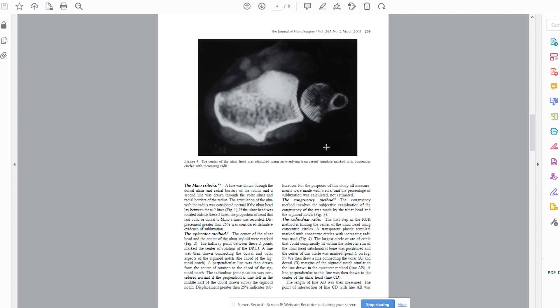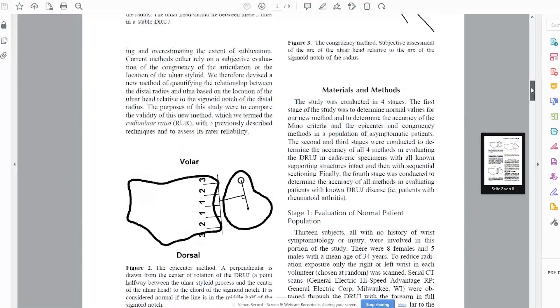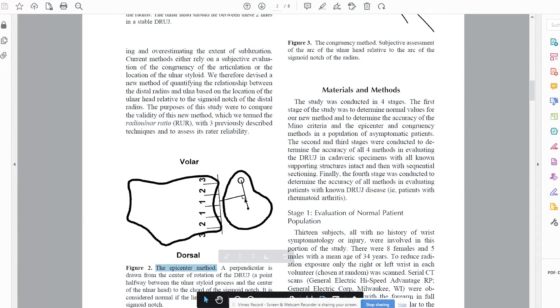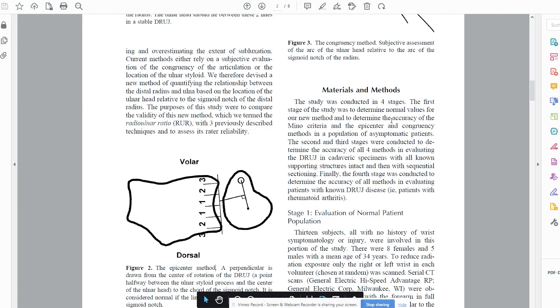Let's look at an article that uses the epicenter method. This is the Journal of Hand Surgery — not a newbie journal. In the illustration for the epicenter method, they draw the line exactly like all the random Google illustrations: center of styloid process, center of the ulna, midpoint, then the perpendicular line drawn incorrectly. It's intersecting within the central 50%, considered stable, but if the patient rotates it would already appear unstable. This is wrong. The study concluded the epicenter method was unreliable and their new method was superior — which is not a surprise given they used it incorrectly.